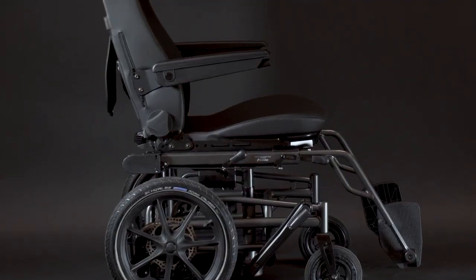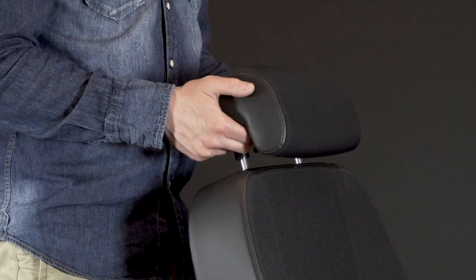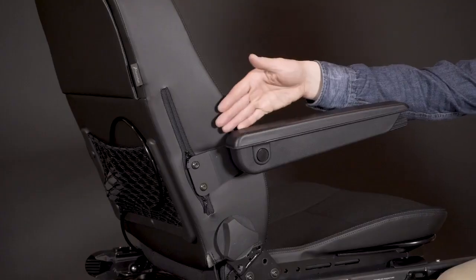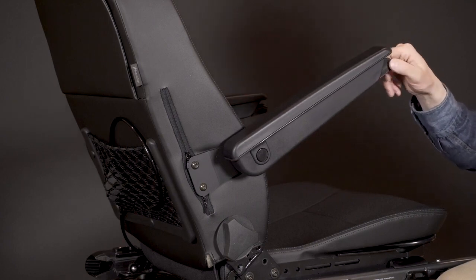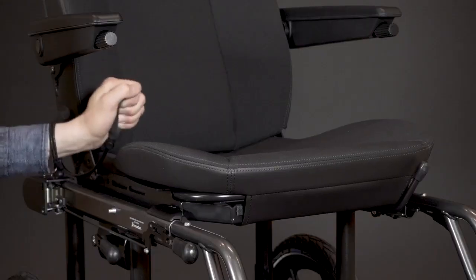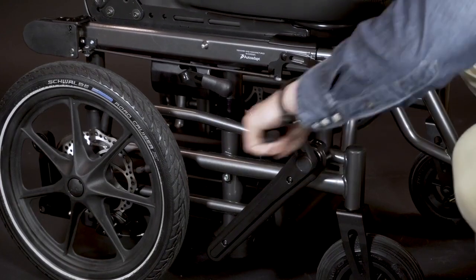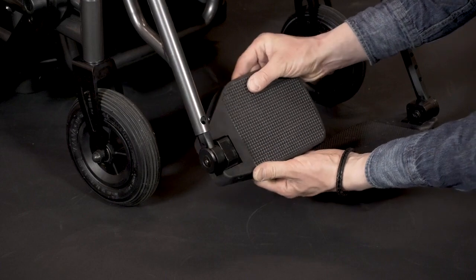Almost everything on the Koroni is adjustable. From top to bottom you can adjust the height of the headrest, the thickness of the lumbar support, the height and angle of each individual armrest, the depth of the backrest and the recline of the backrest, the height of the front of the seat, the seating height of the Koroni, the length of the legrest, as well as the angle of the footrest.